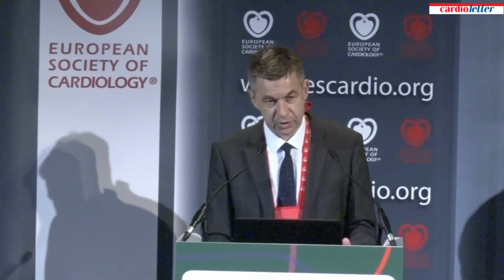So, as I understand it, the FFR value improved, but there was no link to a clear clinical benefit still? No. We need additional data. We need additional studies with clinical endpoints, of course, before considering incorporating OCT as a standard use in acute coronary syndrome patients. But this is probably the first step. This is the first randomized trial showing a potential positive effect on fractional flow reserve on the result of PCI in acute coronary syndrome patients. Thank you.